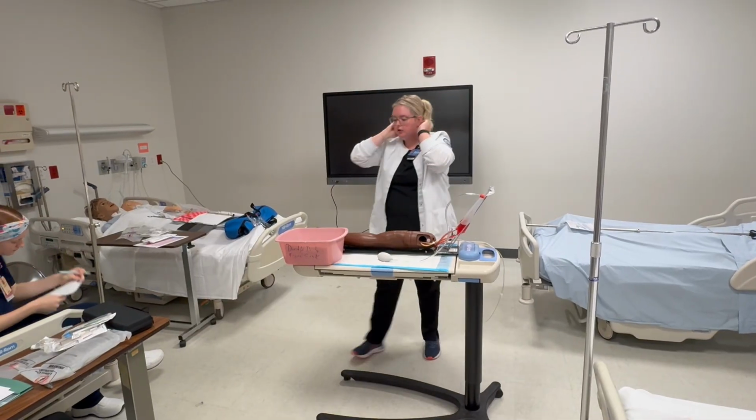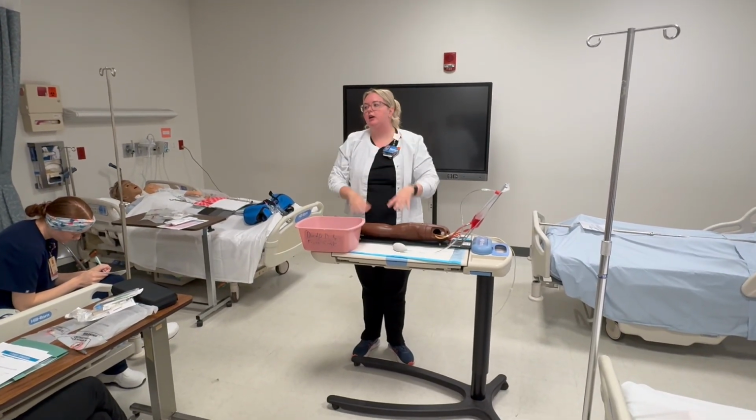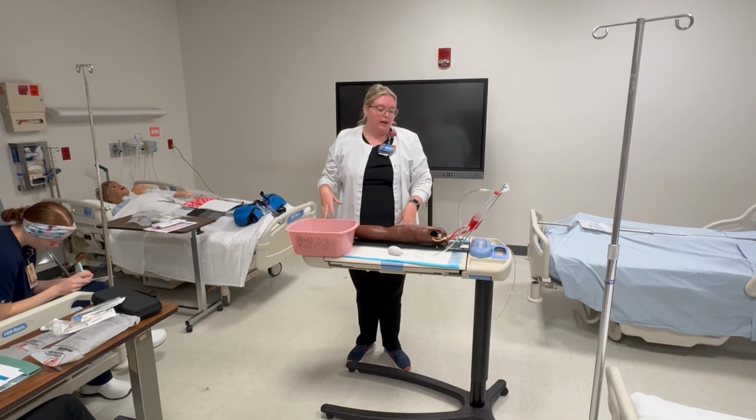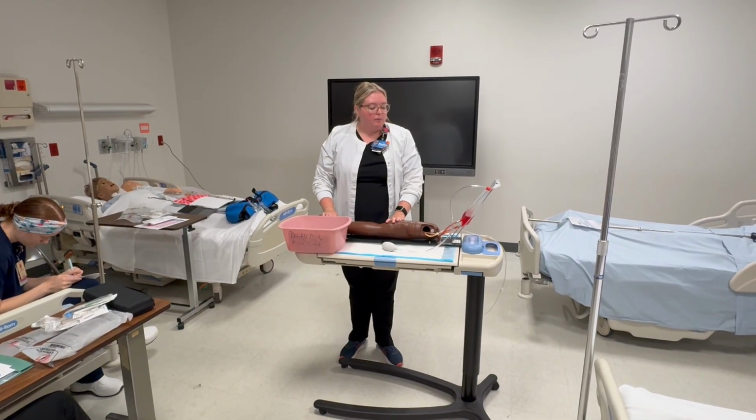All right. So we've done our first med check. We have our supplies. We're going to go in. We're going to do hand hygiene. We're going to verify our patient. We're going to let them know what we're doing. Hi, my name's Alexis. I'm going to be your nurse today. Can you tell me your first and last name and your birthday?